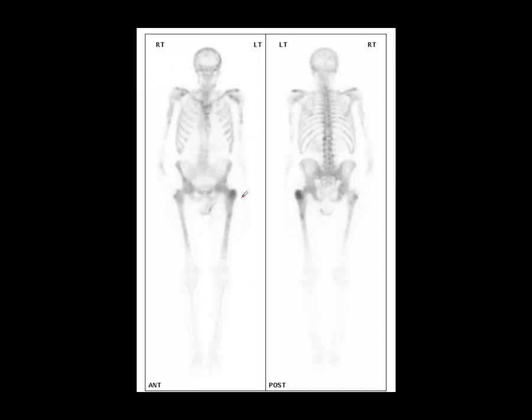doing a bone scan on a patient with hypercalcemia where metastases are being suspected, and you don't want to miss the fact that it's actually due to hyperparathyroidism. Similarly, you might have a patient with renal osteodystrophy. Their bones will be abnormal on other imaging modalities because of the renal osteodystrophy, and you have to be very careful that you don't accidentally jump to the conclusion that they have metastases.